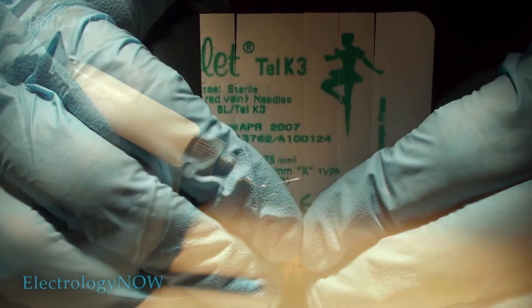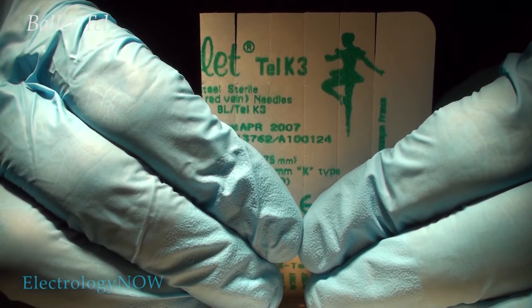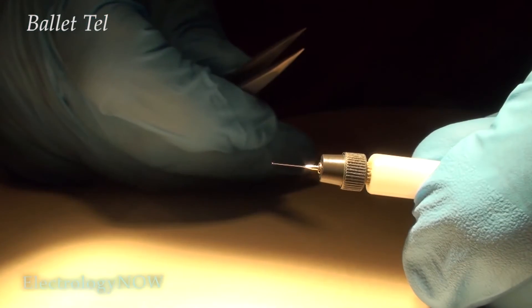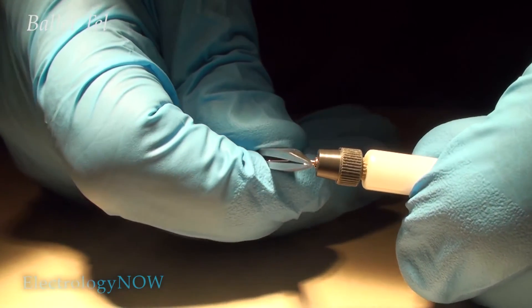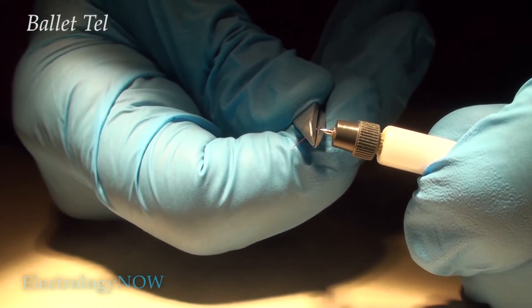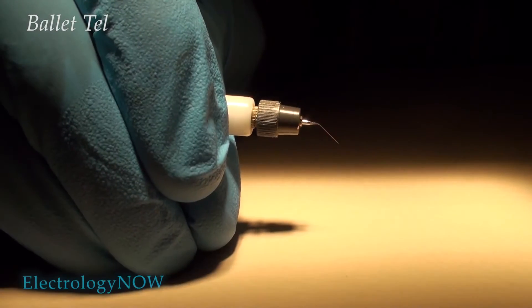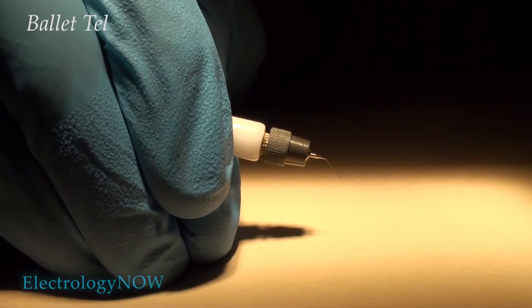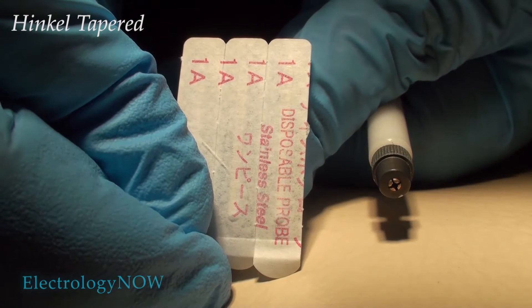These are your Ballet Tell K-3 needles that were specifically designed for removing telangiectasia. The Ballet Tell needle also cannot be bent in the shank, but it's fine because you're only going to be using the tip of the needle. Here's the proper positioning for your Ballet Tell needle, and you're going to be using it like this most of the time.